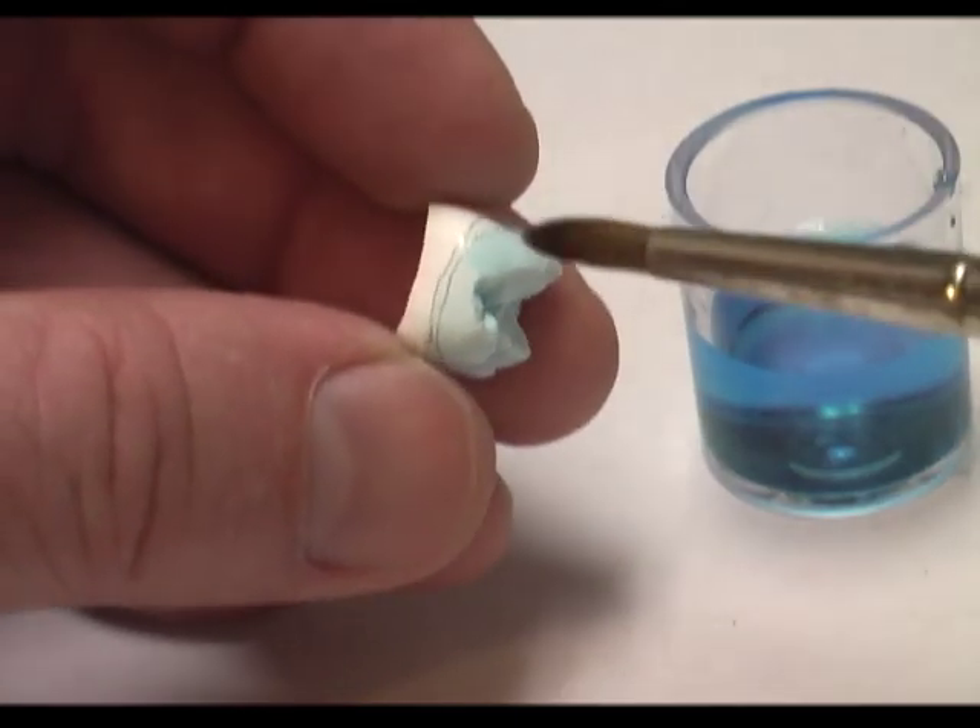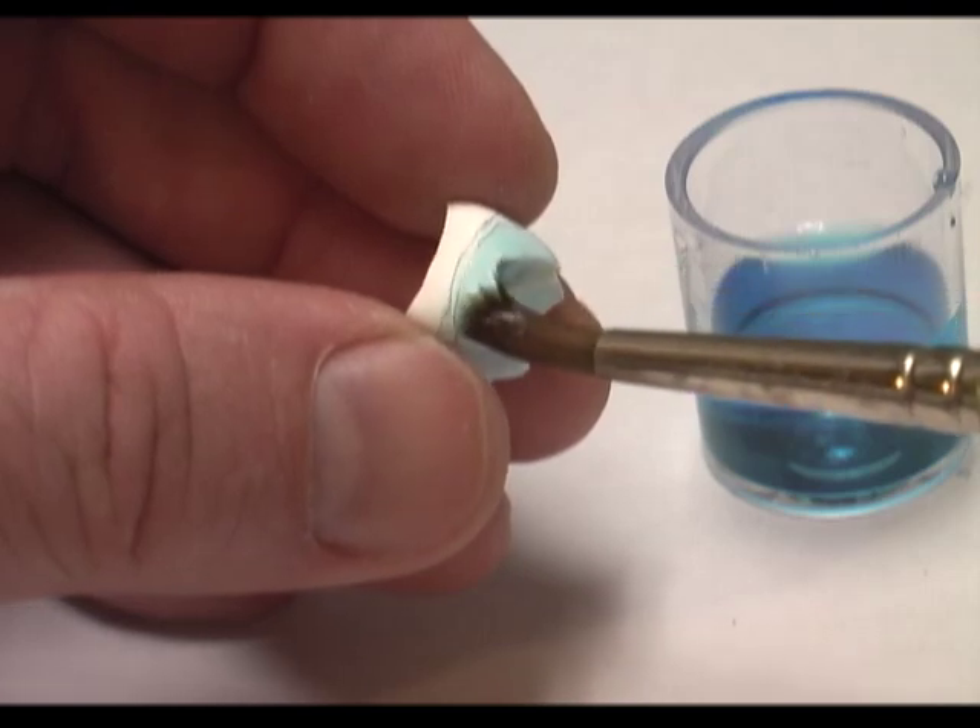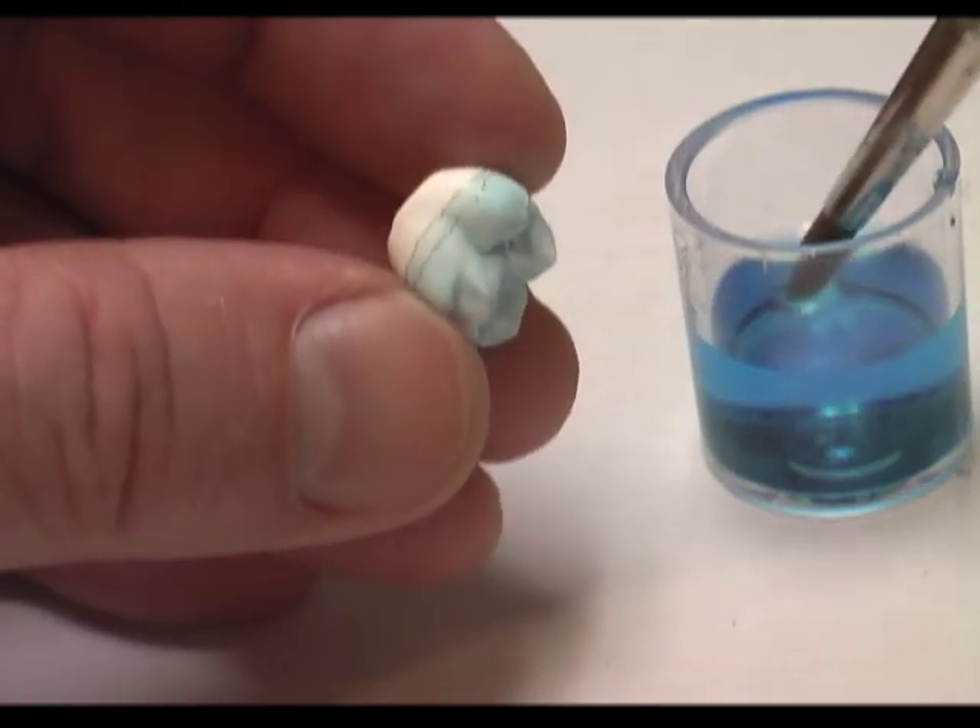And we're going to go circumferentially around the crown, staying up at the line closest to the occlusal. So let's go.